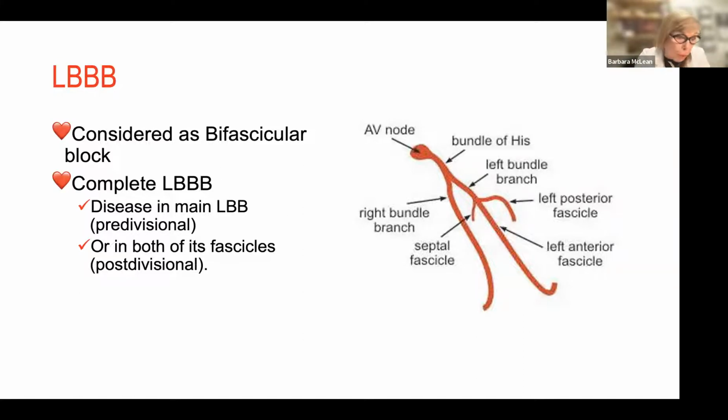Now, it used to be a lot more important when you had somebody with really a rapid heart rate and you couldn't tell whether it was ventricular or supraventricular with the right bundle branch block pattern. You treated those two dysrhythmias very differently. In today's world, it's not nearly as important because we treat them the same. We give them both potassium channel antagonists. Of course, that's amiodarone. And so that's made things a little bit easier, not requiring the same amount of critical thought to analyze the bundle branch block pattern, but it still is significantly important for us to do.